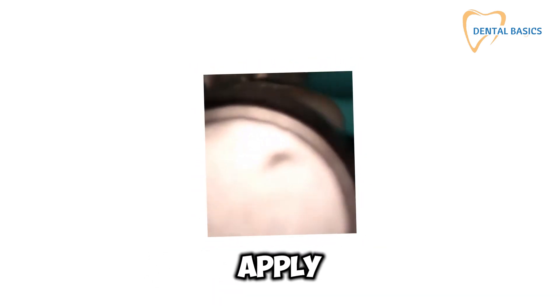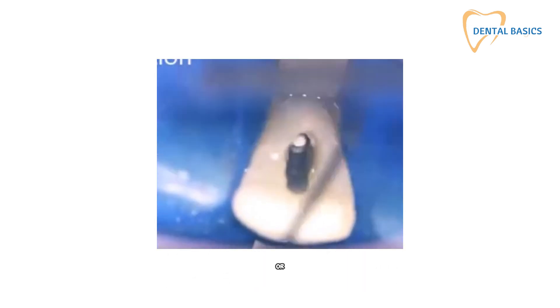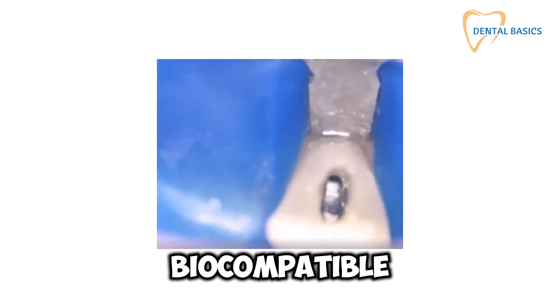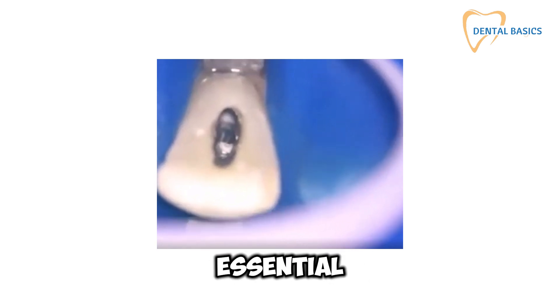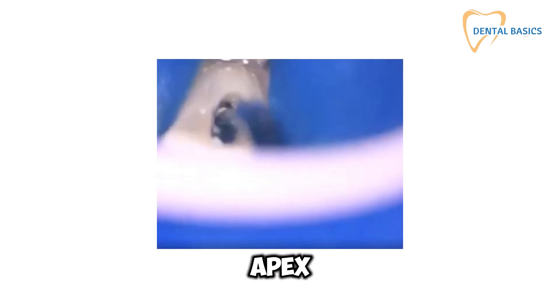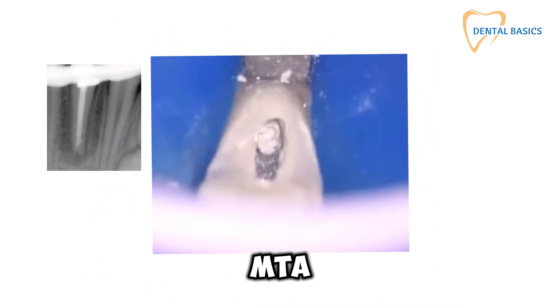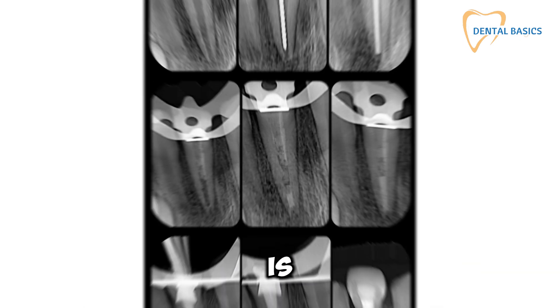When it's time to apply the apexification material, reach for mineral trioxide aggregate, or MTA. This superstar material is biocompatible and promotes hard tissue formation, perfect for creating that essential calcified barrier at the root apex. Confirm the placement with a radiograph, make sure that MTA is perfectly positioned and the barrier is complete. Adjust as needed because precision is key.